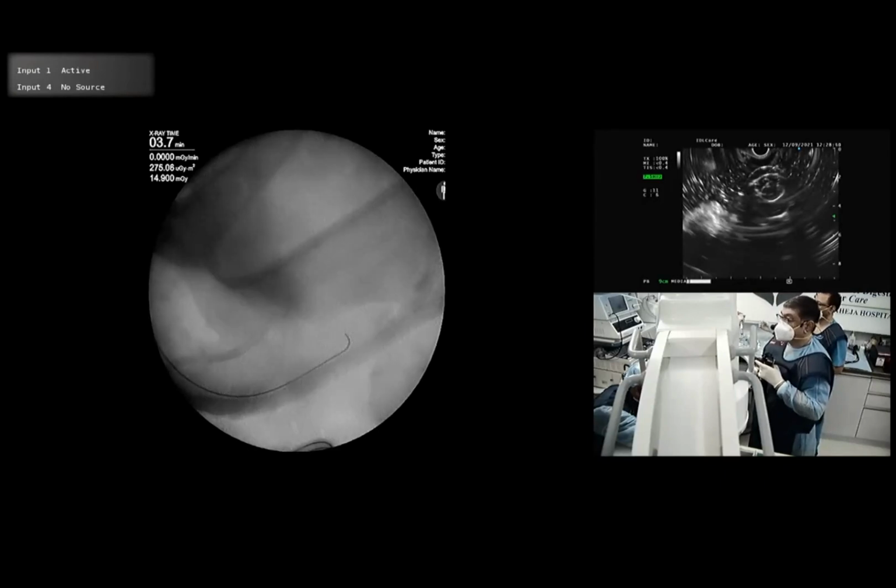Now you see, can you see Bipin's hands? The wire is finished. So he's putting a syringe there and he's flushing saline with force while I will withdraw. Fluoro? So now you see how fast I can withdraw this, and it is out. Very, very useful method for short wires.